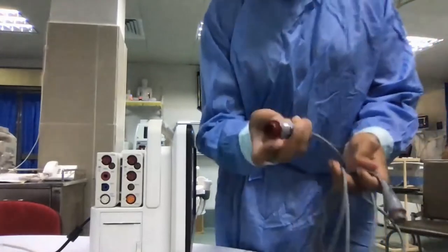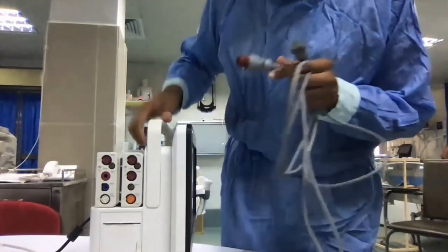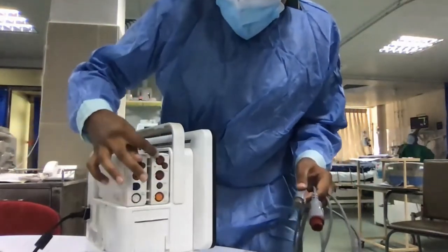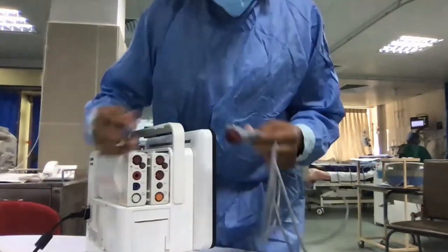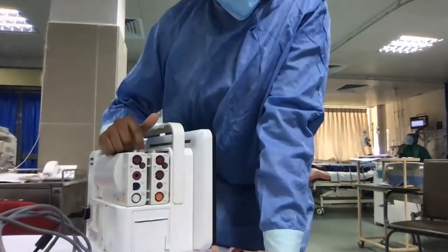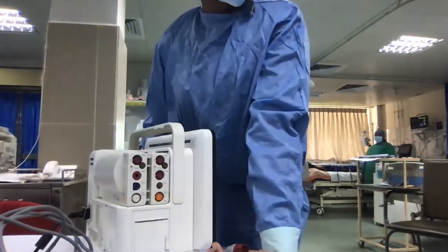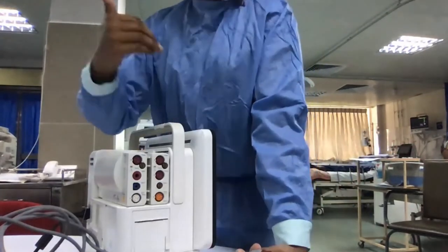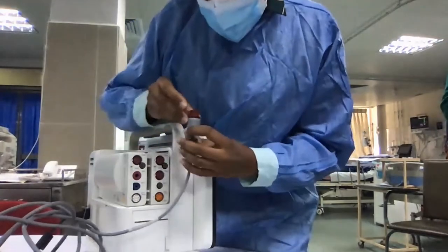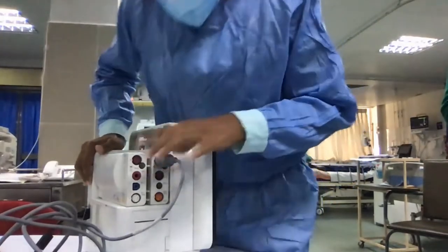No problem. So this is one arterial cable, and like I told you, you need two invasive lines like this. You can use any of these ports, so altogether you have three pressure monitoring ports here, and you can connect whichever you like. The only thing is that if you are using our monitor, whichever port you connect to, you have to define that on the monitor, madam. Otherwise the monitor won't recognize which port you inserted the arterial or CVP line into. So I will insert this IBP cable into this extension. It's just a click like this.